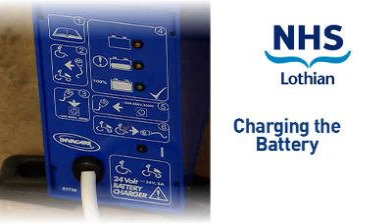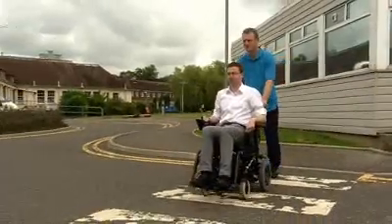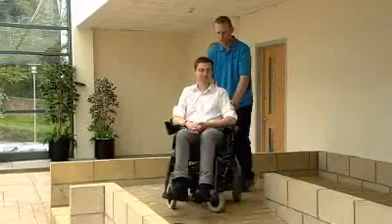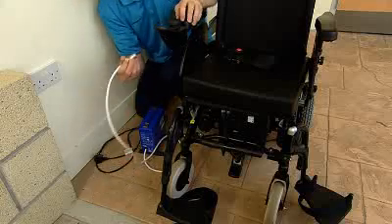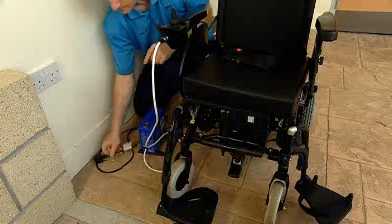Charging the battery. Powered wheelchair batteries have a good capacity, which will last a whole day under normal conditions. This will vary depending on a number of factors, including speed, distance, slopes and model of chair. The battery can be plugged into a normal electrical socket and left to charge overnight.